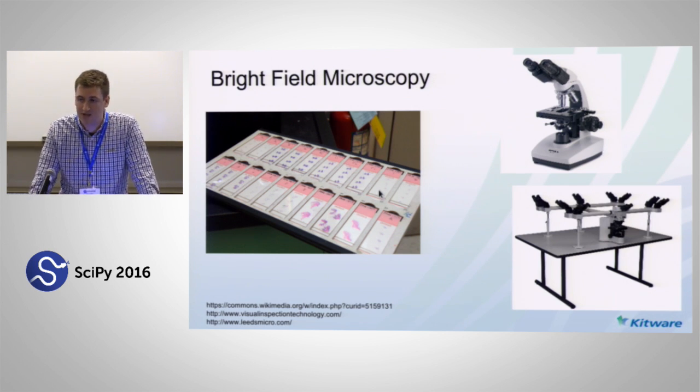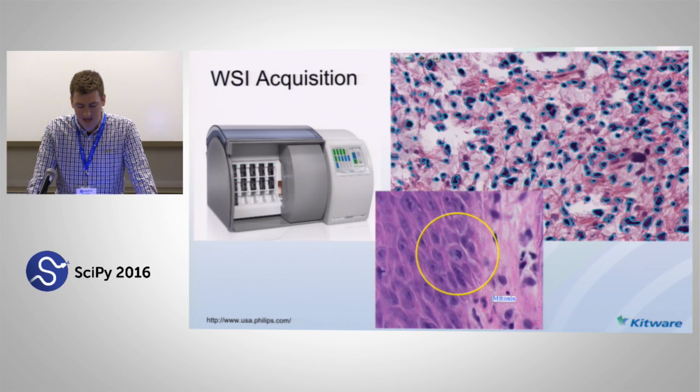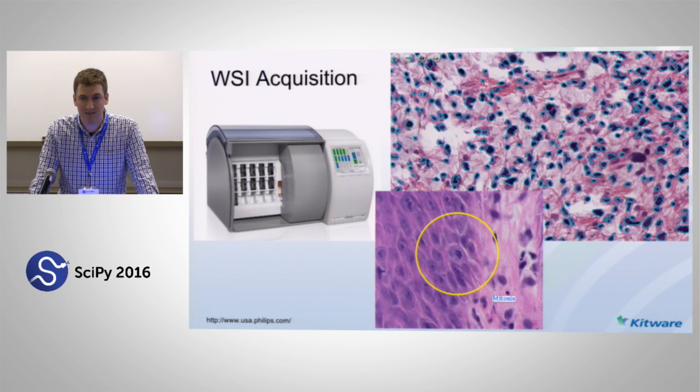But luckily, in research and in a little bit of education, whole slide imaging and digital techniques have started to catch on. In many cases this is almost a completely automated process at every point after you end up with an actual glass slide. We have robotic imaging devices. We have automatic ingestion and curation algorithms. What I'm going to talk about here is an attempt to improve the tools for workflows and the analysis and data mining of images within whole slide imaging for cancer research.